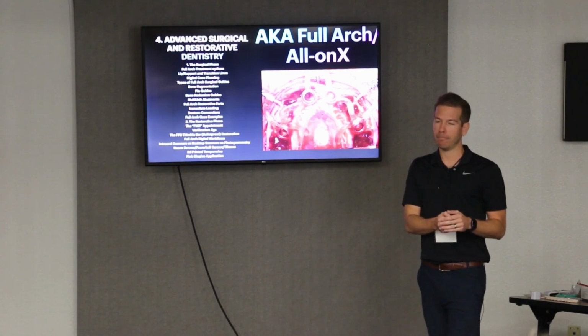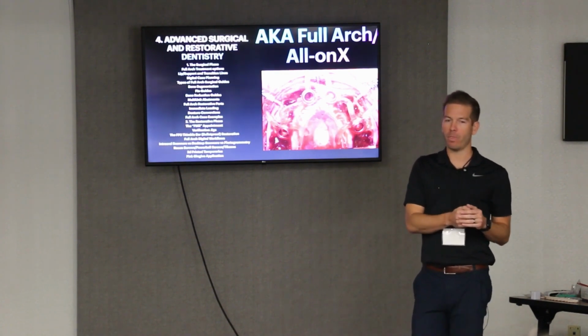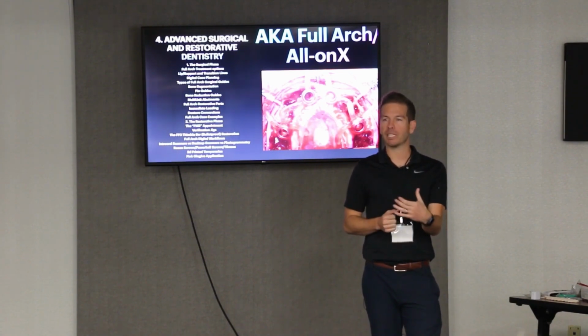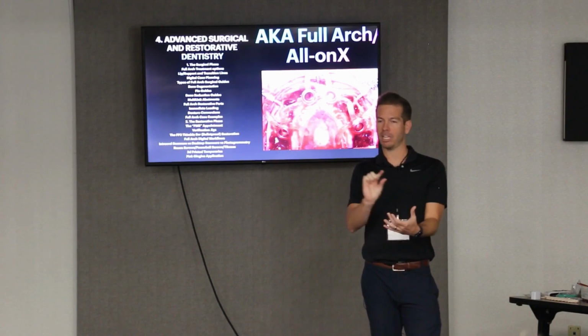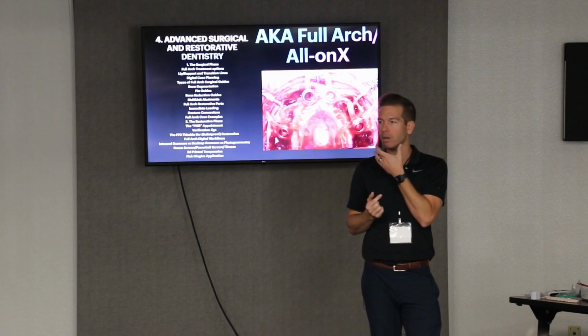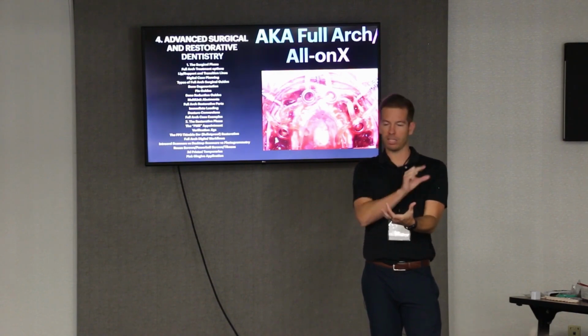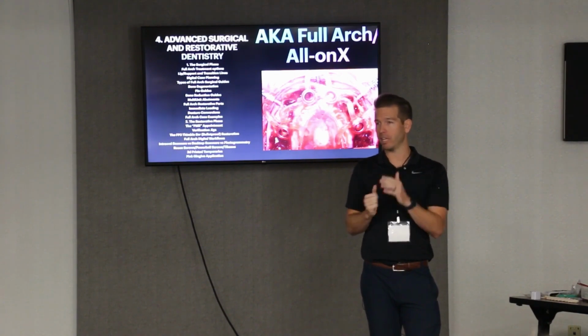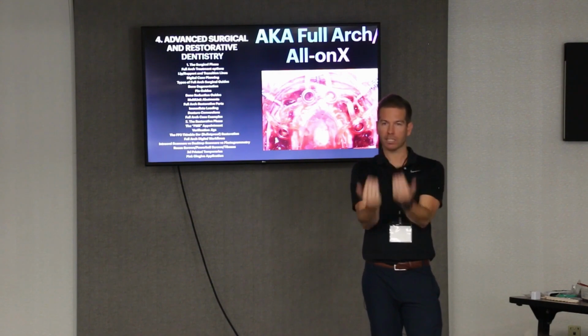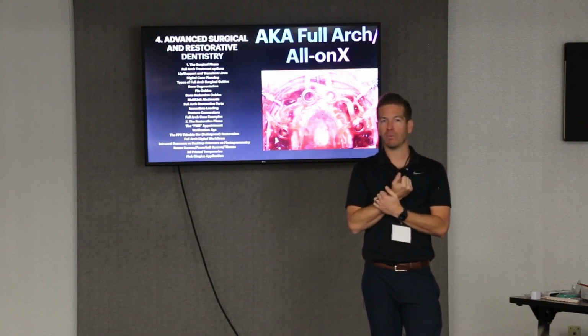The best surgeons that I've seen, best case scenario, they'll have a duplicate denture with just a big lingual window behind the teeth, for an upper. And they'll sit that in there and say, okay, as long as I'm in this giant window, anywhere lingual to the teeth, I know my restorative dentist can restore the case without a screw hole access coming out the facial. And that's really the best that's being done.